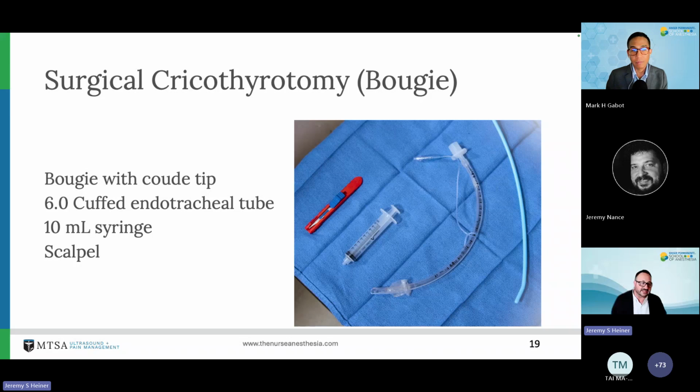Another important piece of this is that if you're ventilating with a transtracheal jet ventilator, we should have somebody up at the top of the airway performing a jaw thrust, or some other means for gas to egress and allow exhalation. Otherwise, we could get ourselves into a barotrauma situation pretty rapidly. So that's a great point in terms of the pressure.